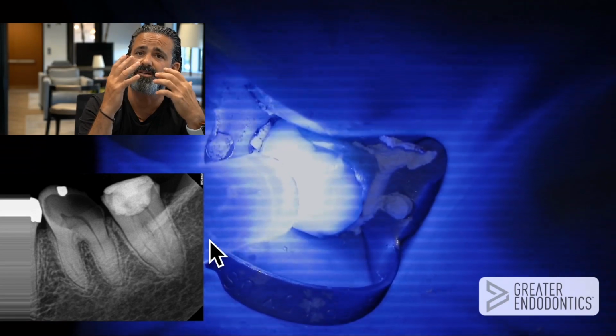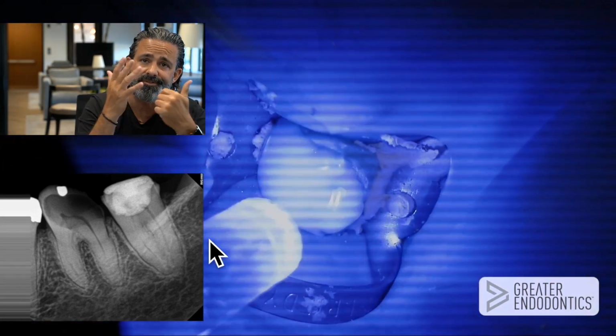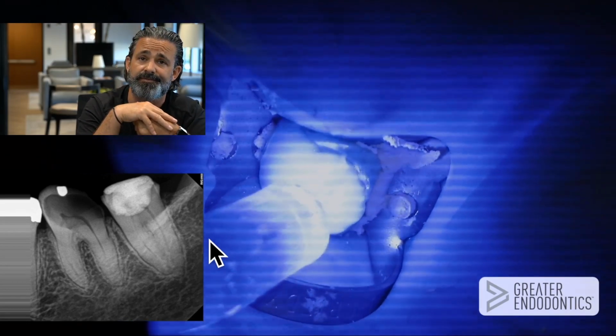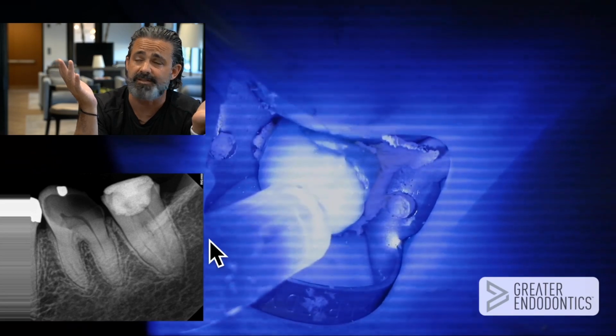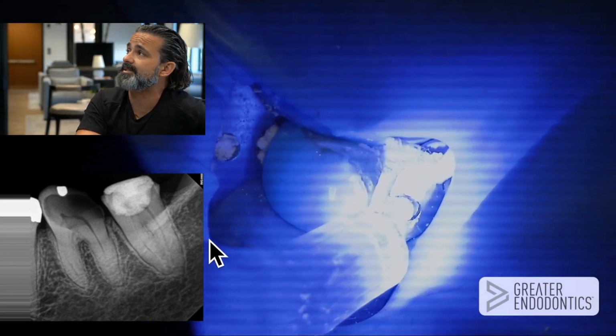I want to make sure I get a good tight seal, so when I run the GentleWave, it works and it's not going to leak on me. And I find this very effective. I haven't had an epic fail like this. It just works, and so I'm just showing you what I do in these compromised scenarios.